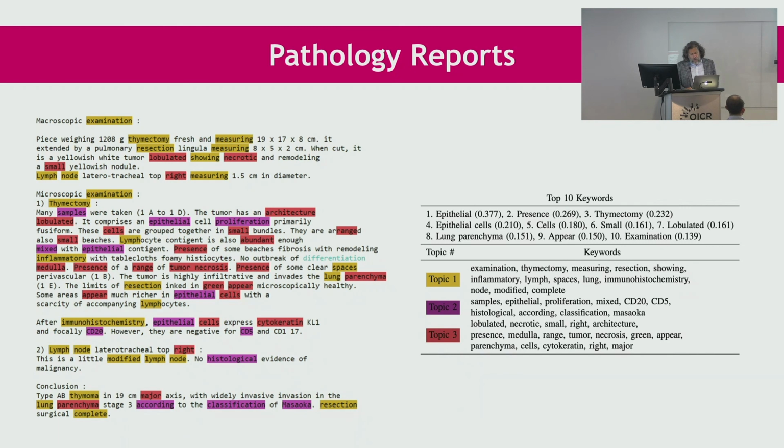But what we can do with pathology reports, and many people have started looking into that, is go through some natural language processing, get the keywords, get the phrases, so topics within the pathology reports can be recognized. And again, I'm circling back to the NCI data with 33,000 glass slides and corresponding pathology reports.